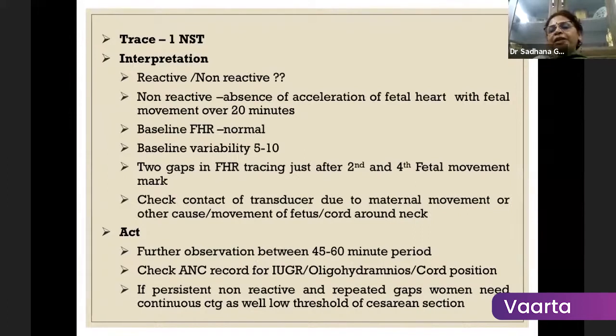It is better that we extend the monitoring for another 60 minutes to see what is happening, that it is not the fetal sleep pattern. And if there is persistent non-reactive and repeated gaps in CTG, we may omit that fetal movement is causing the gap. But whenever there is a gap, we should be a little careful about it. So these patients should have the continuous CTG. And if the patient is having another risk factor like hypertension, IUGR, oligohydramnios, we can have the low threshold of the cesarean section.